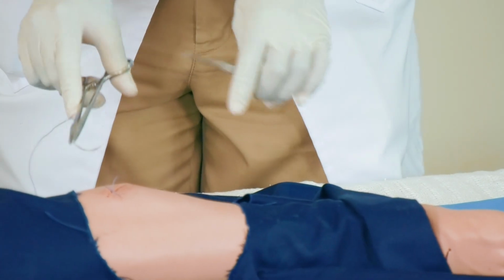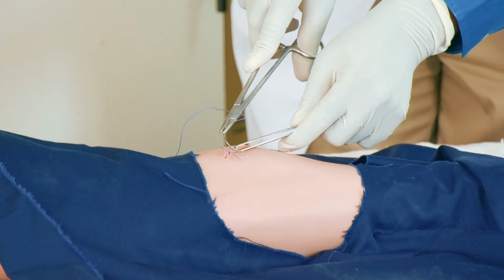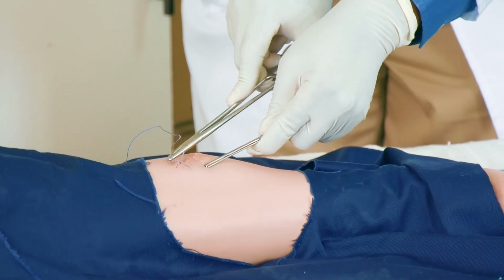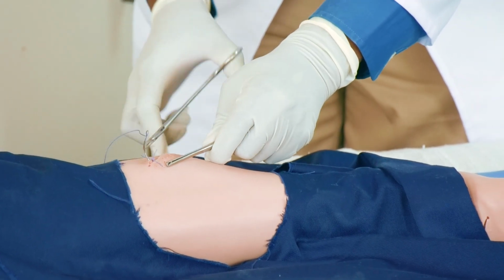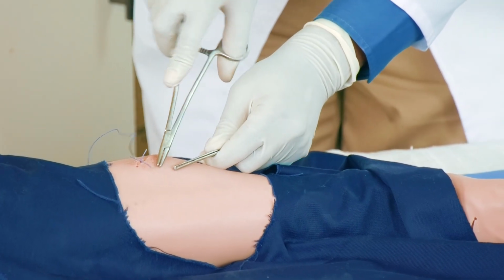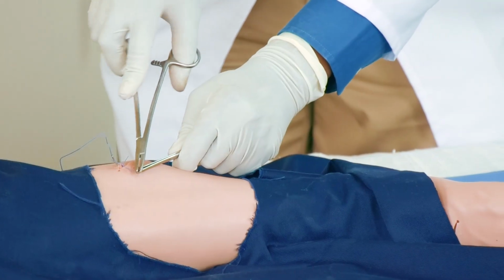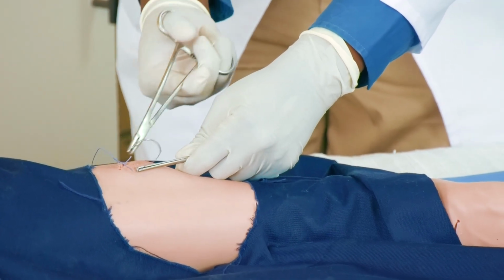Remember, just a third from where the stitch is. Again, tooth dissecting forceps just to help you. So there should be at least 1 centimeter in between the stitches. Okay. Comes out here, hold it. Remove, pick this. So that wasn't okay. It happens even when you're doing this on an actual human being. So, pull, pull, pull, pull.